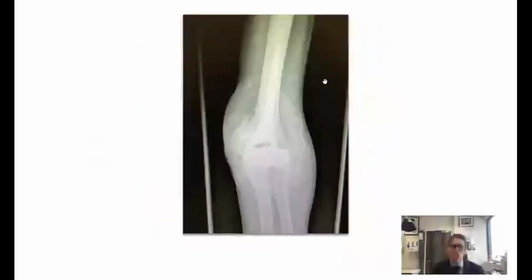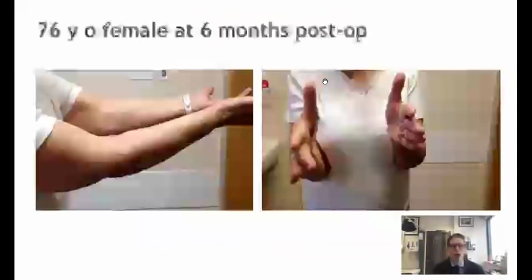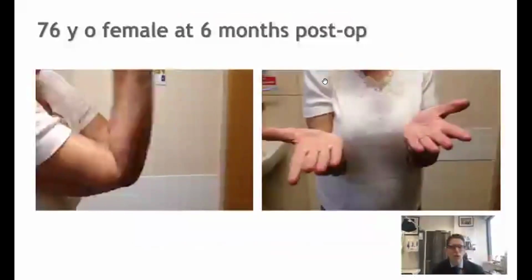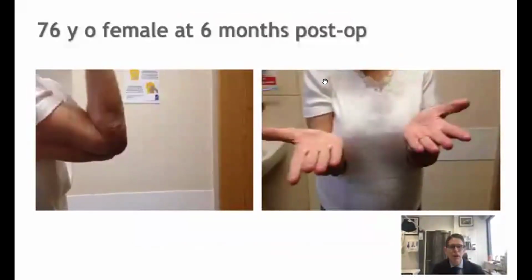And what we found is that in the vast majority of cases these unite with callus formation. Over 90% of them go on to union. Where they don't unite, we haven't seen any problems or complications associated with that. There's no problems of instability or pain that we've witnessed in association. So this is a patient with a non-union, but a very satisfactory outcome, good range of movement, and a pain-free elbow.